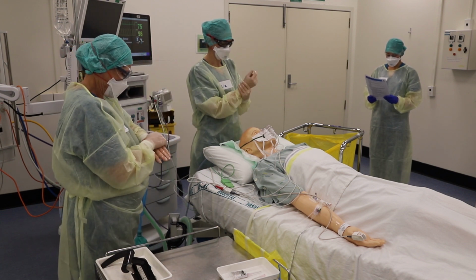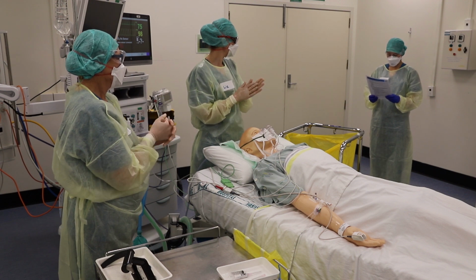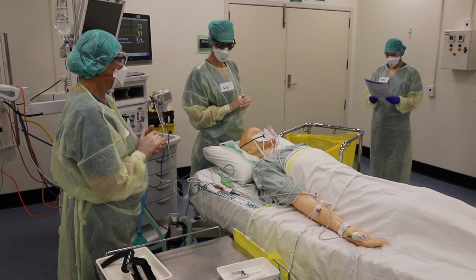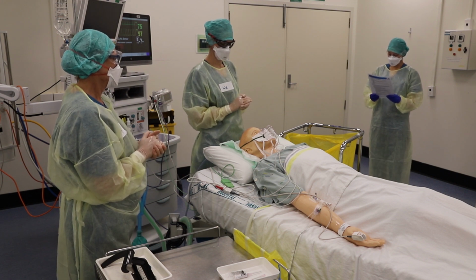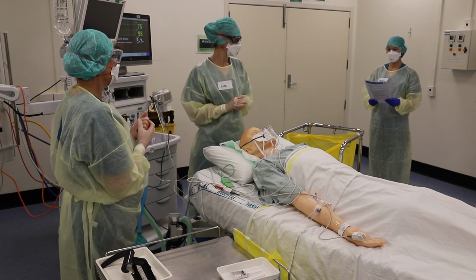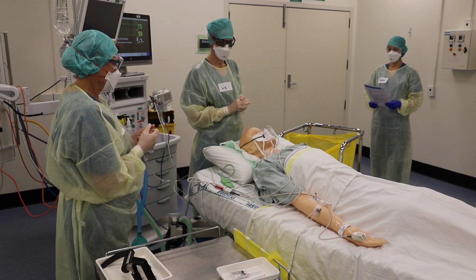Ten minutes stand down begins now. I will start the timer. Suction is left in place under pillow. Reminder, after patient leaves room, suction is turned off and disposed of intact with canister. Great, thanks everyone.